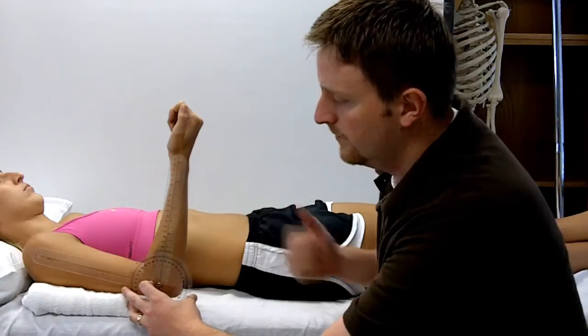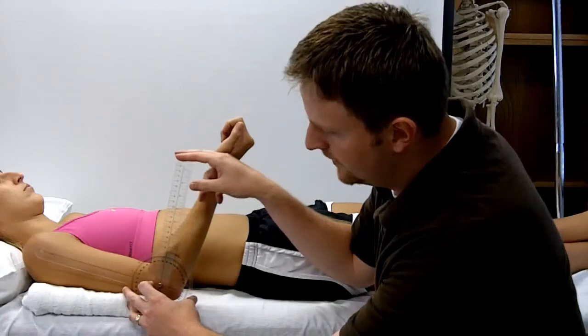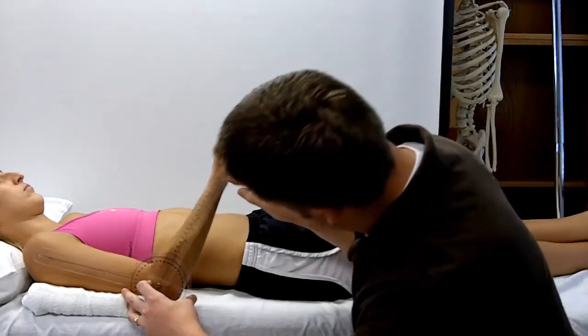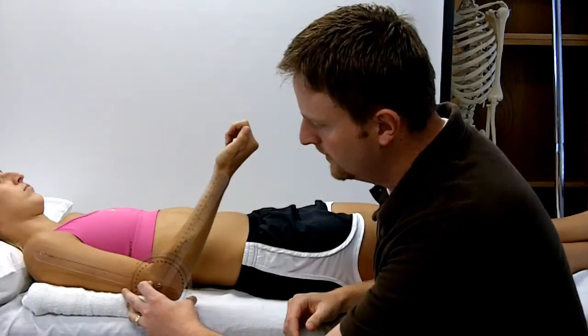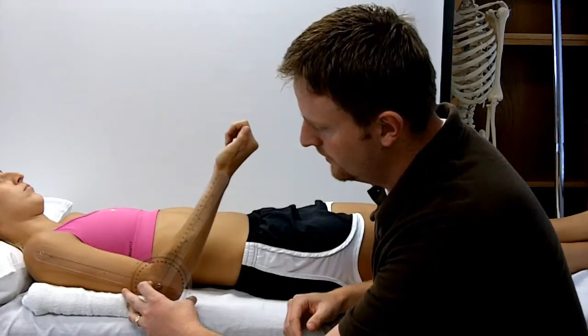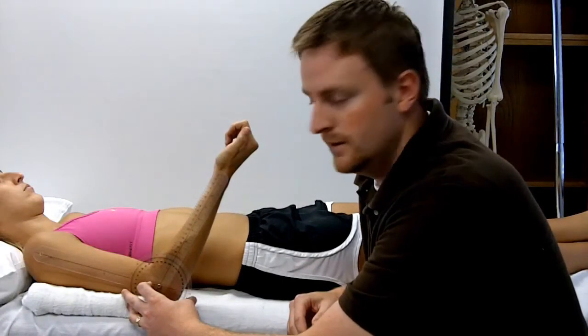We can also measure extension. In this case, the movement arm just follows the radius — everything else stays the same. You would say that you're measuring minus 105 degrees of elbow extension in this case.